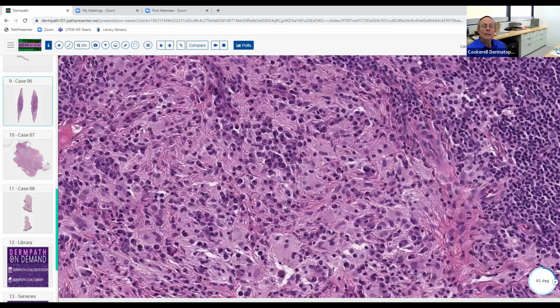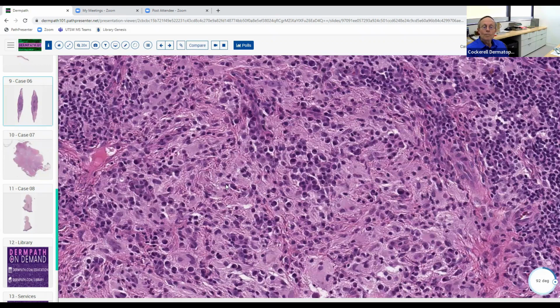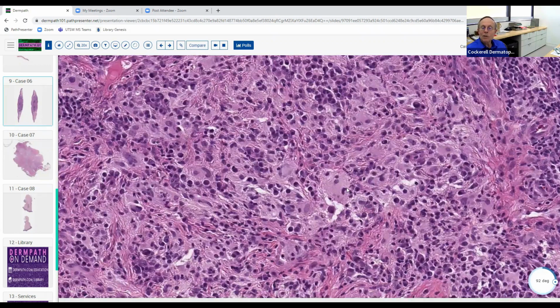Good. So what kind of histiocytes are these? We have a lot of different kinds of histiocytes that we can talk about, right? Yeah. So are you asking about the pattern of histiocytic inflammation? Well, we can get epithelioid histiocytes, we can get Touton giant cells, we can get Langhans giant cells with multiple nuclei, kind of looking like a horseshoe.